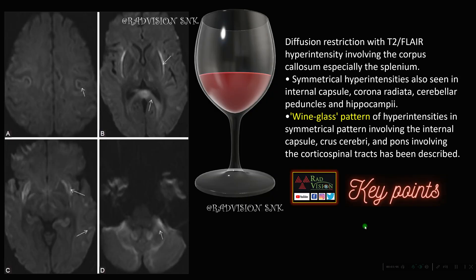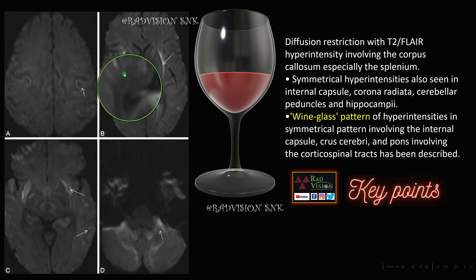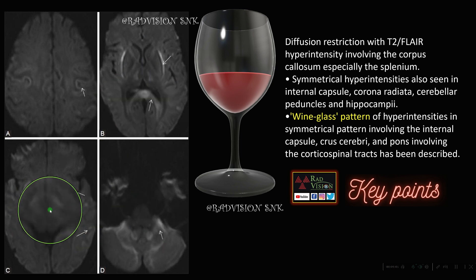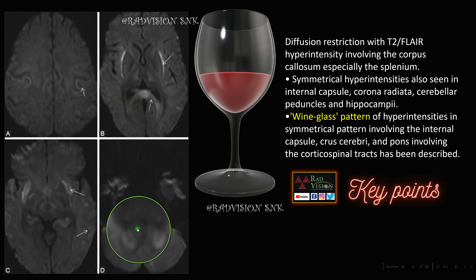Next: a postpartum lady presenting with altered sensorium and seizures. You can see there is restricted diffusion on DWI in the internal capsule, along the corticospinal tracts, in the splenium of corpus callosum, along the crus cerebri, and in the middle cerebellar peduncles. Whenever you get symmetrical restricted diffusion on DWI in the internal capsule, along the corona radiata, along the corticospinal tracts, involving the splenium of corpus callosum, in a wine glass pattern on coronal sections — this clearly resembles the wine glass pattern.